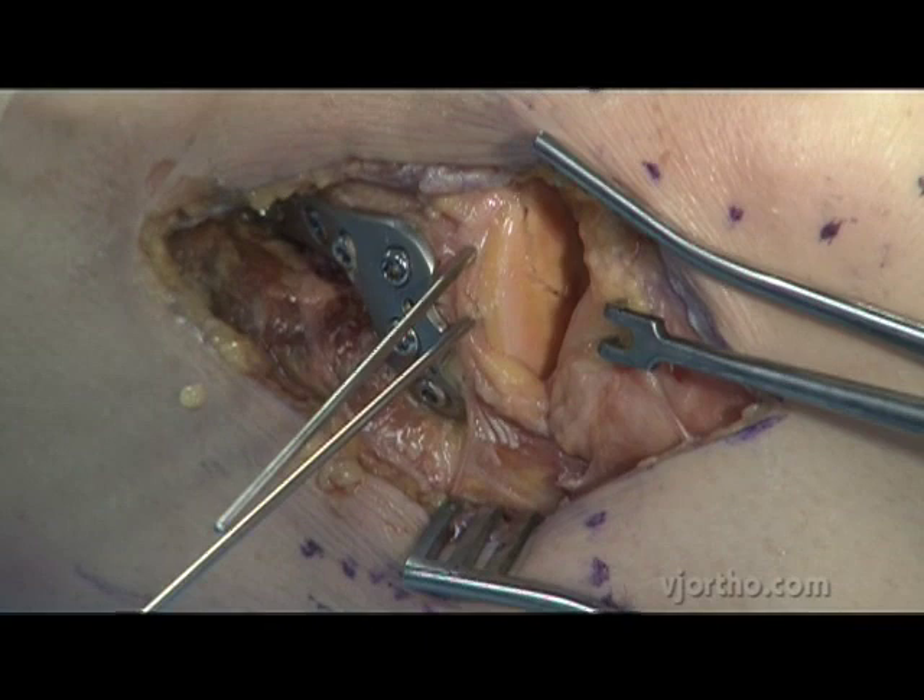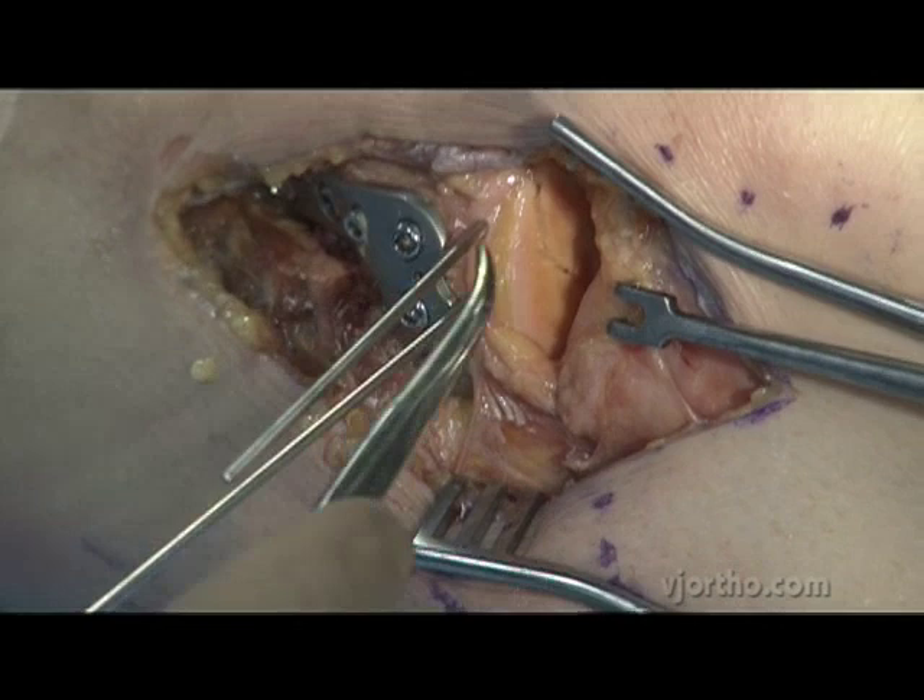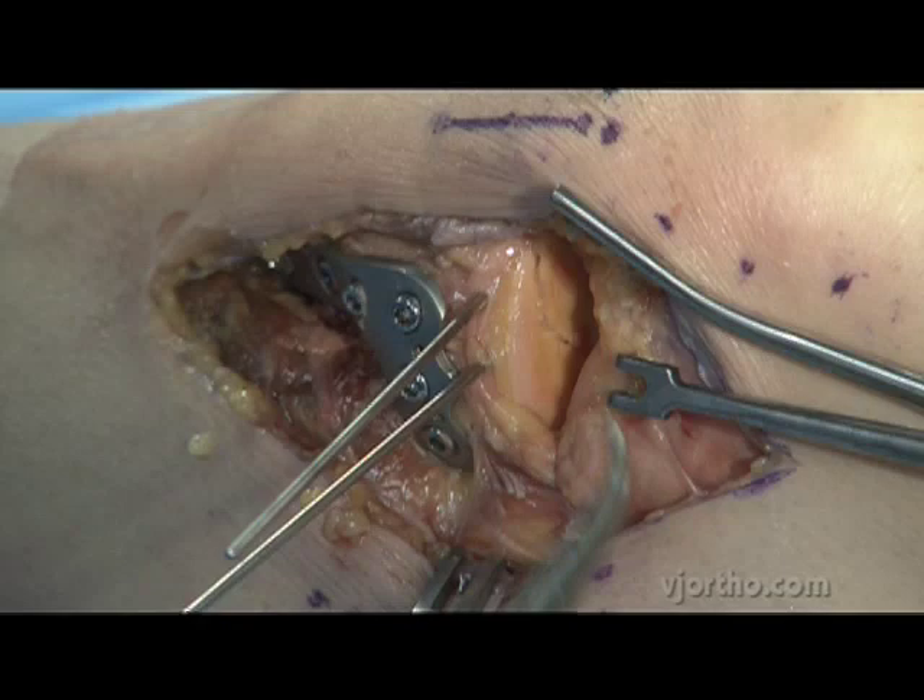The plate has now stabilized the metaphyseal region and restored the rim part of the fracture complex. The problem is that even though we fixed this, the metaphyseal piece could potentially still move.